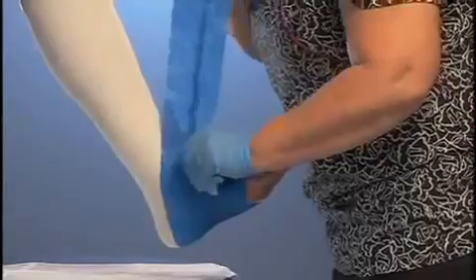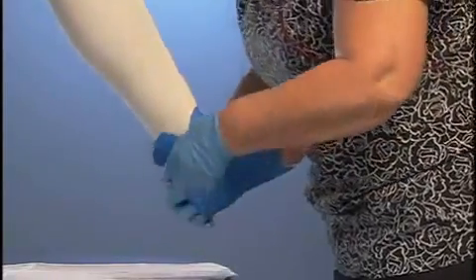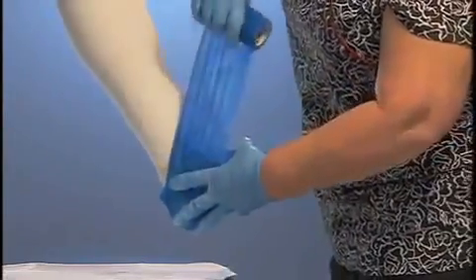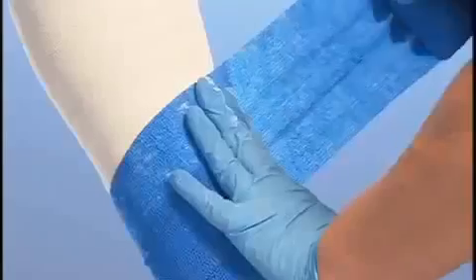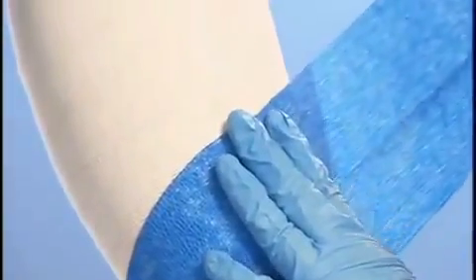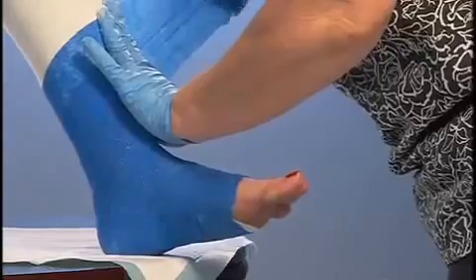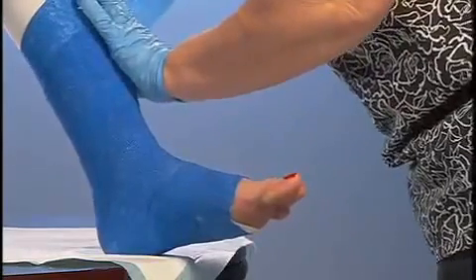Upon reaching the heel, start the wrap by pulling six to seven inches of bandage away from the roll. While the bandage is stretched, wrap around the heel area. When reaching the ankle, stretch the bandage out another six inches, then relax it back to 50% tension. Wrap around the ankle two turns at 50% tension. Continue up the leg with 50% tension and 50% overlay, stopping at the top of the paste bandage.